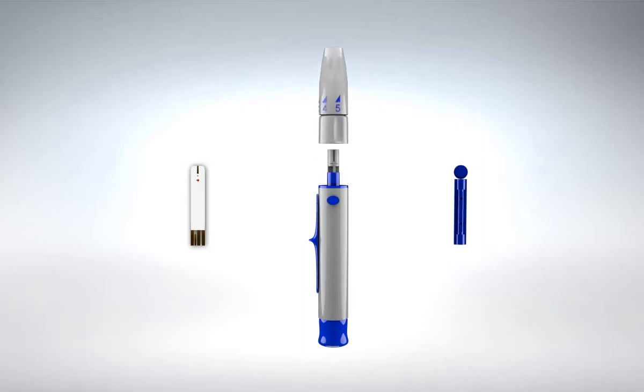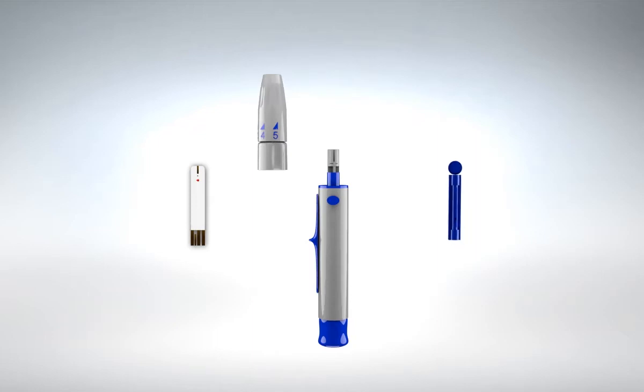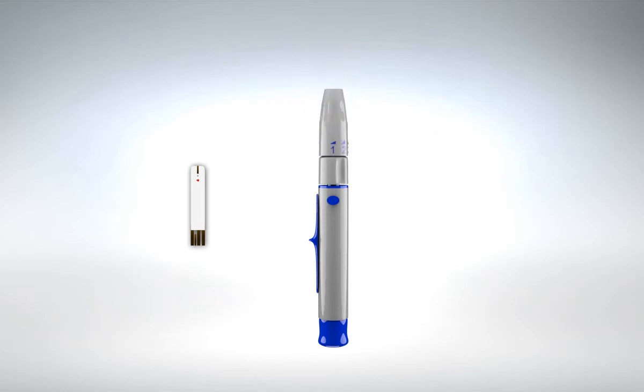Switch the upper part of the lancing device to the right so it will be positioned above the blue line until it has detached from the device. Insert a new lancet into the white lancet holder cup. Hold the lancet firmly in place with one hand. Use your other hand to twist off the rounded top, then place back the top part of the lancing device.